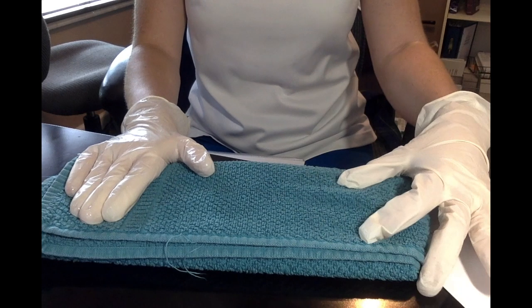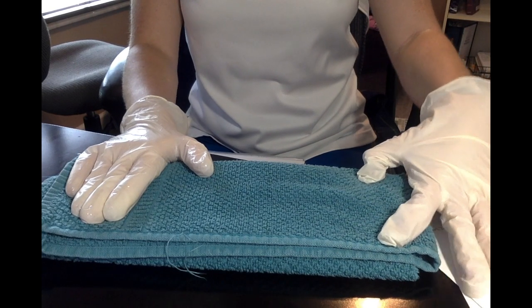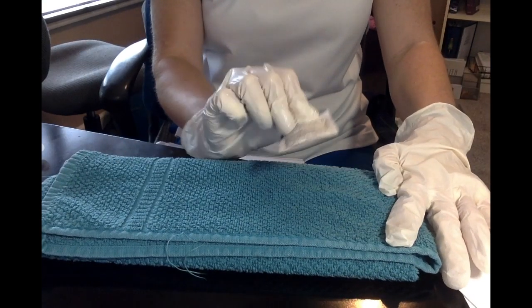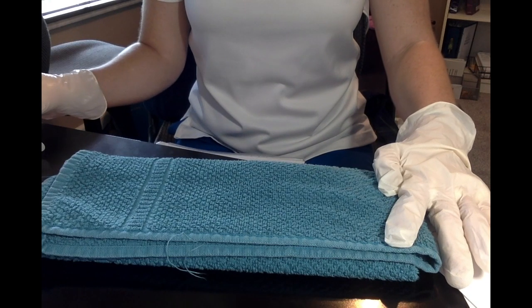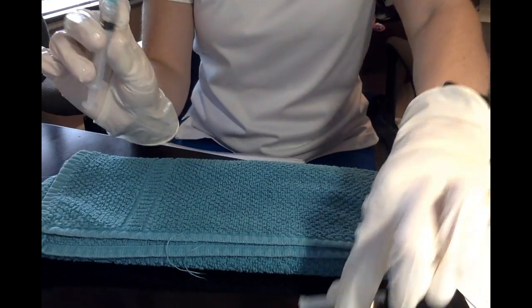So if you can pinch 1 inch of skin, you're going to go in at a 45-degree angle, and if it's 2, 90. So we have our patient's arm right here. We're going to go ahead and we're going to clean the site for 30 seconds, and then we're going to let that air dry. And then we're going to grab our needle, and we're going to uncap it.